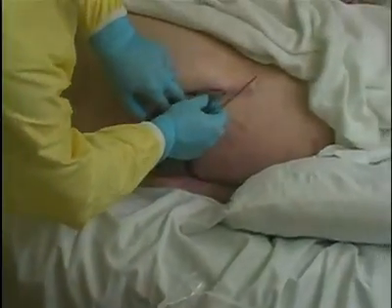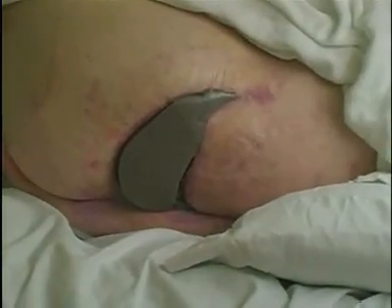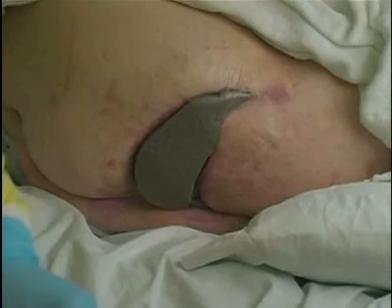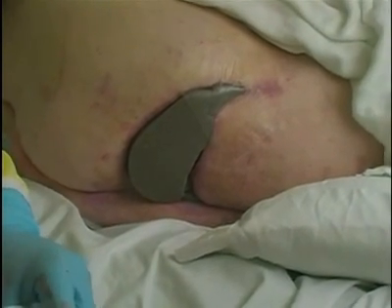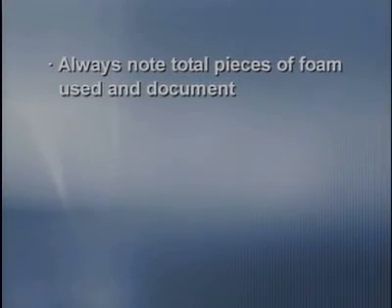Gently place the foam into the wound cavity, covering the entire wound base and sides, tunnels, and undermined areas. Count the pieces of foam and annotate the total number in the patient chart. Also, annotate on drape with permanent marker.